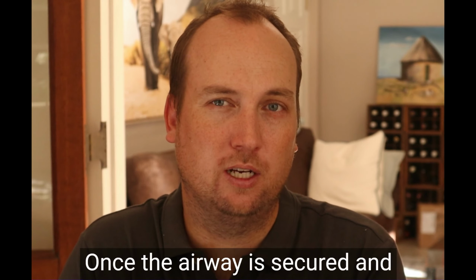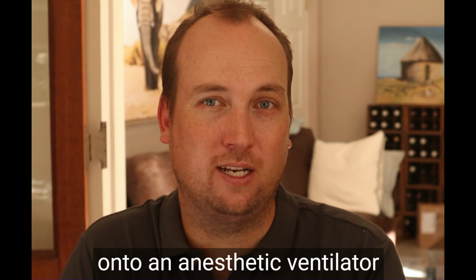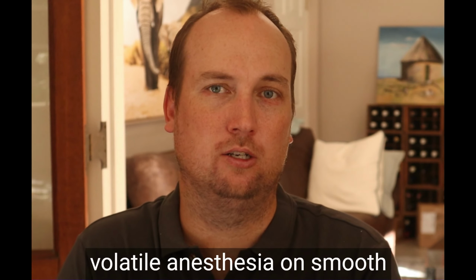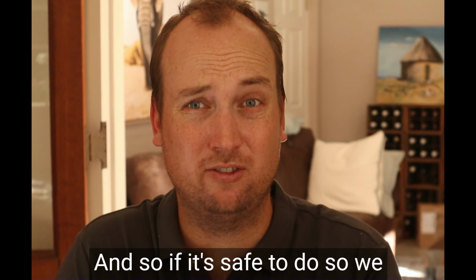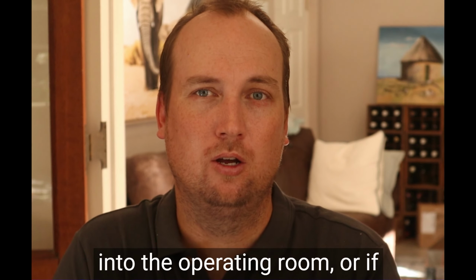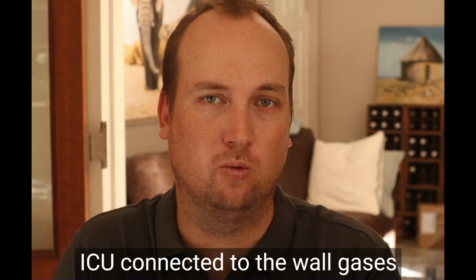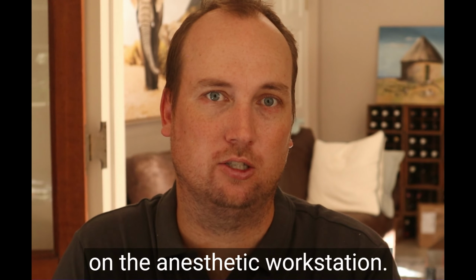Once the airway is secured and we are ventilating the patient, it's quite useful to get the patient onto an anesthetic ventilator as soon as possible because of the beneficial effects of volatile anesthesia on smooth muscle tone in the airways. And so if it's safe to do so, we can rapidly move the patient into the operating room, or if we're in an ICU environment, we can actually bring one of the anesthetic workstations into the ICU, connect it to the wall gases, and start ventilating the patient on the anesthetic workstation.